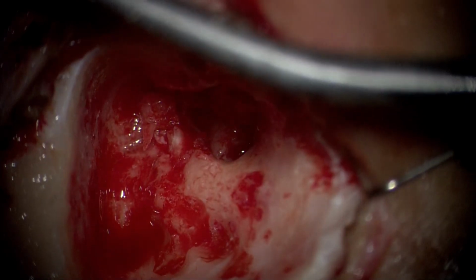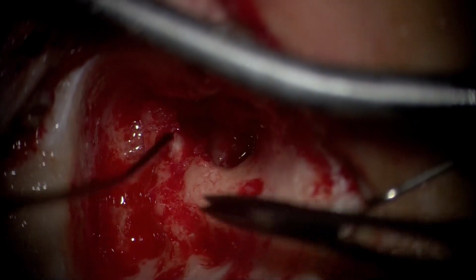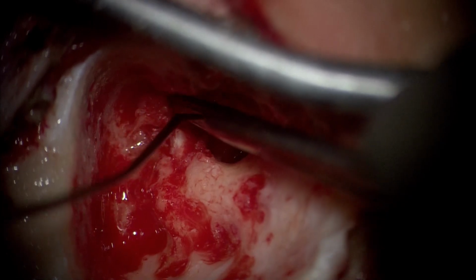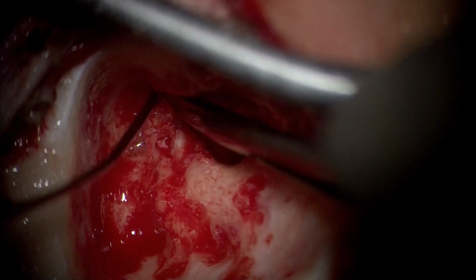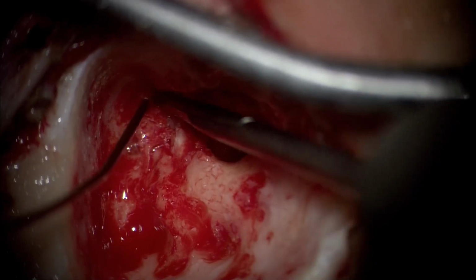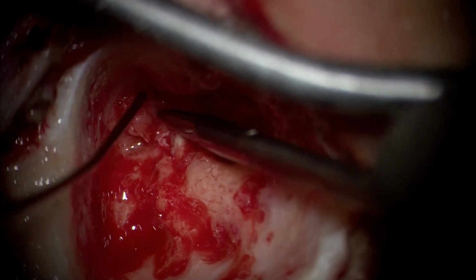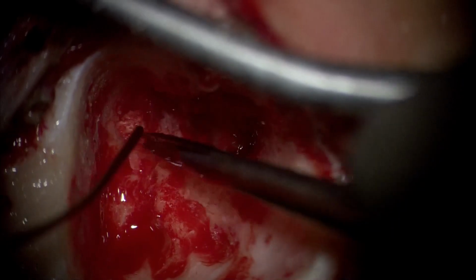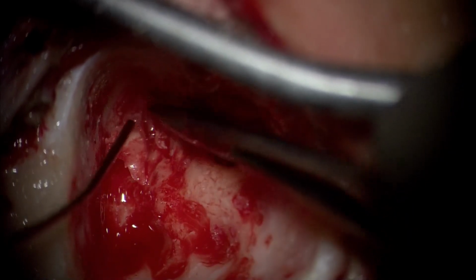And what you are also seeing is that we are using a very thin, controlled suction, because a large or inappropriate suction is very often the cause of damage to the facial nerve and to the stapes. You'll see us, in this intricate part of the surgery, using less blunt and more sharp dissection, because this way you reduce the traction on an inadvertently missed dehiscent facial nerve. Sometimes the granulations could be affecting the facial nerve directly. So sharp dissection obviously is much more advantageous than blunt dissection, which leads to a lot of traction trauma.